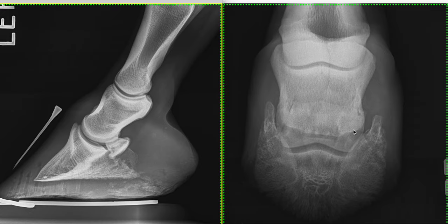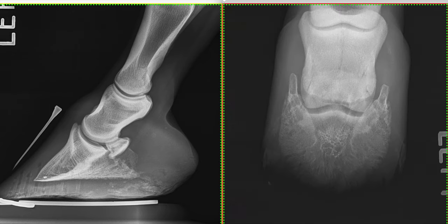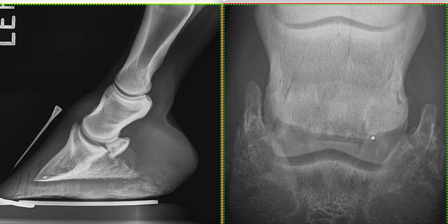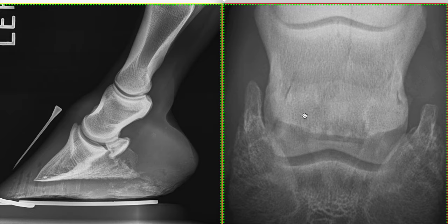If we move on to our dorsoproximal palmarodistal oblique view, I'm just going to zoom in on our navicular bone here and look at it in a bit more detail. So I'm just outlining the distal horizontal border of the navicular bone here. We've got our lateral and our medial sloping border and then we've got our proximal border here. The first thing we're going to focus on is our distal horizontal border and we look at our synovial invaginations — the little invaginations that are happening on the distal horizontal border.